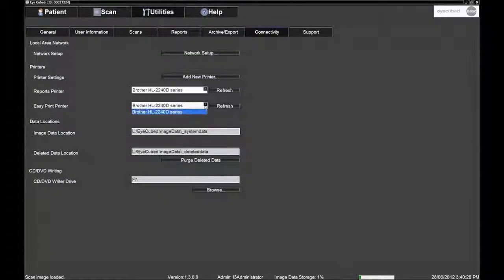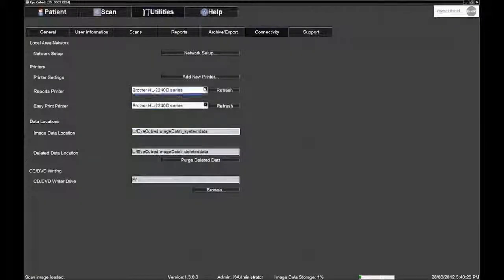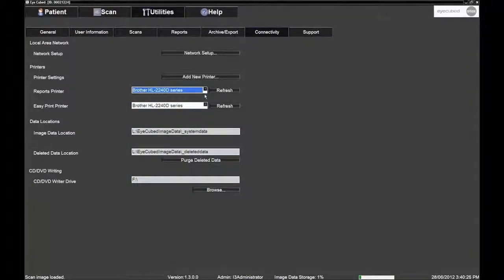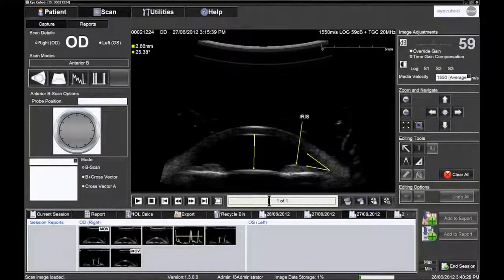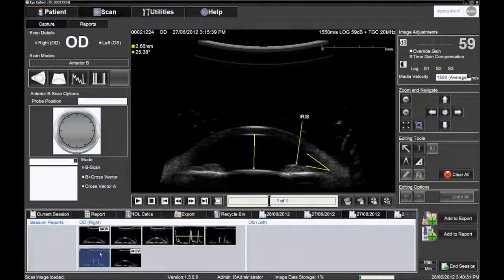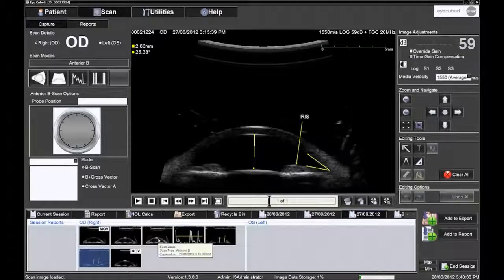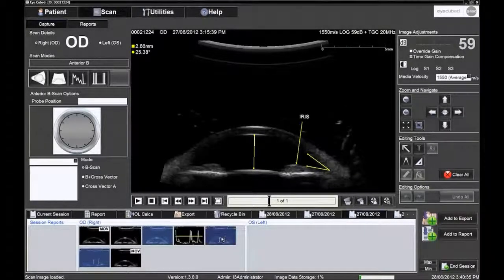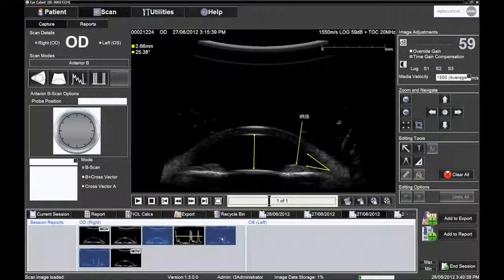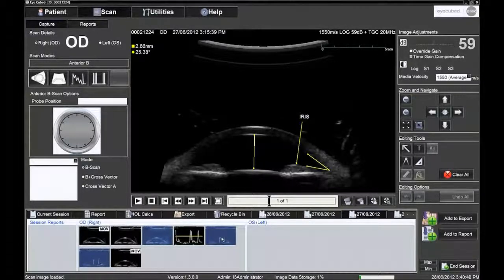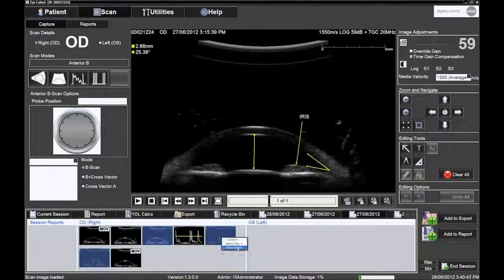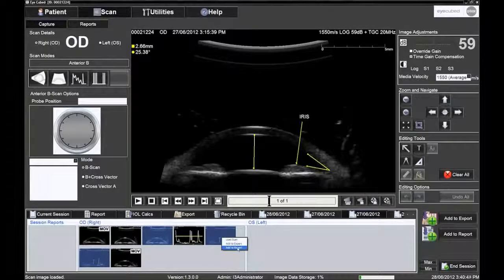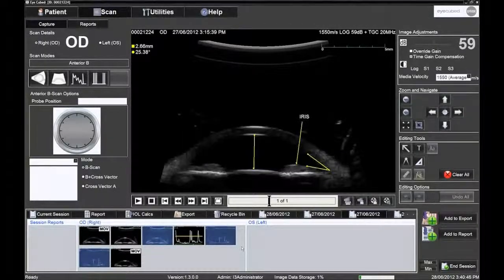Simple or multiple images can be sent to the standard report bin. In the image tray bin, choose the image or images to be printed by clicking on and highlighting them. Either right click the image and select Add to report or click the Add to report icon directly to the right of the image tray bin.